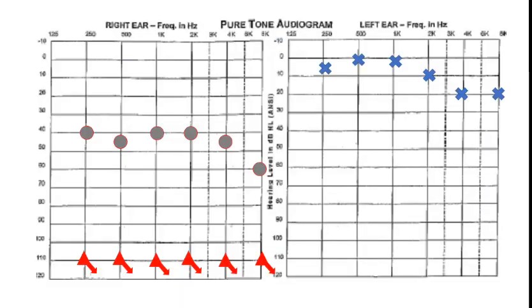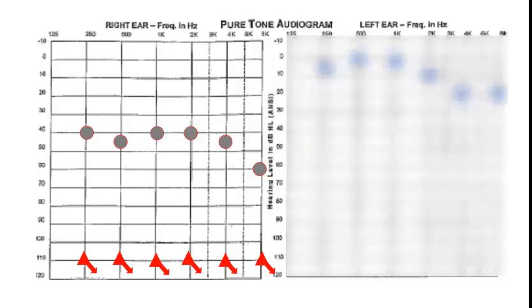Once a non-test ear is properly masked, we collect valid responses from the test ear because we've removed the non-test ear from the picture.